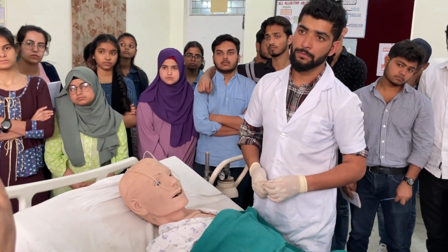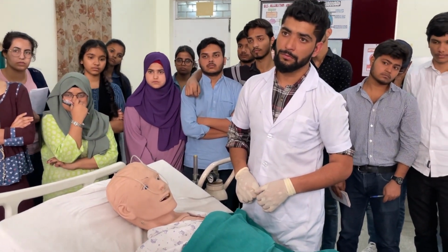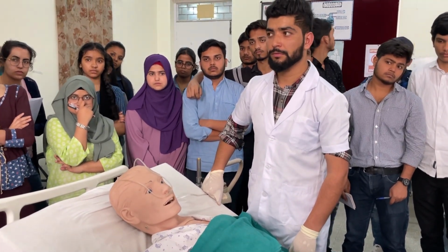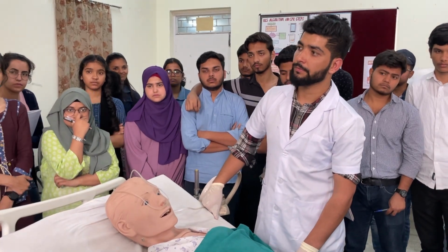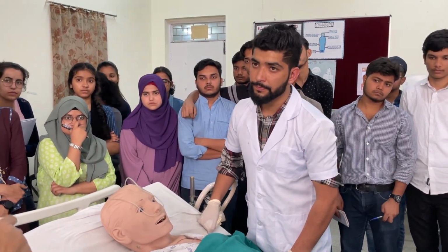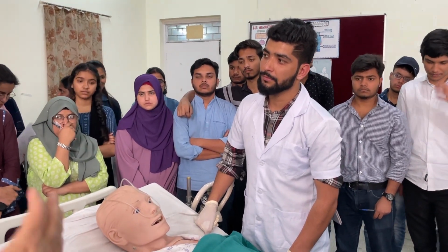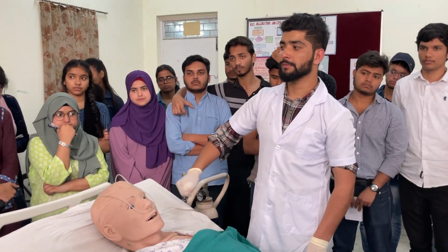There are portable oxygen cylinders also nowadays. Patients are carrying them home also. At home also, those patients who have to survive completely on oxygen therapy will carry portable oxygen cylinders. But in the hospital, it depends upon the patient's condition, if they are asthmatic, and how frequently the patient has to be given, that doctor will mention it. Okay.